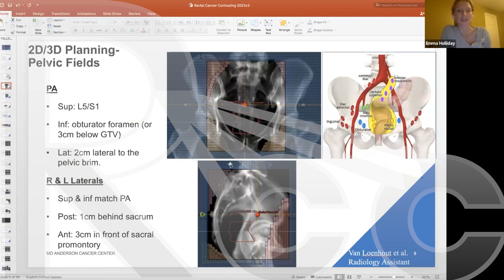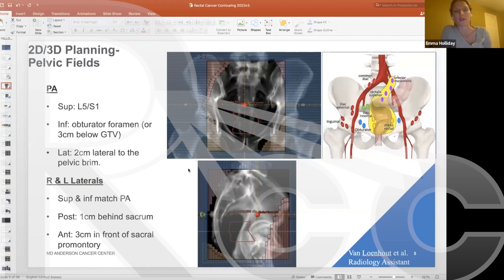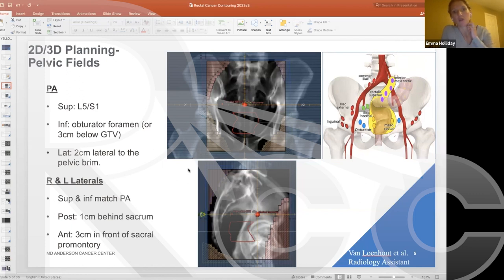This is a contemporary case treated with a 3D technique. I almost entirely start with a 3D plan when planning radiation in the preoperative setting for rectal cancer. Unless there are extenuating circumstances — such as a large amount of bowel in the field from a prior prostatectomy or hysterectomy — I will almost exclusively use 3D conformal radiation with a PA beam and two laterals for the initial prescription of 45 Gy in 25 fractions.